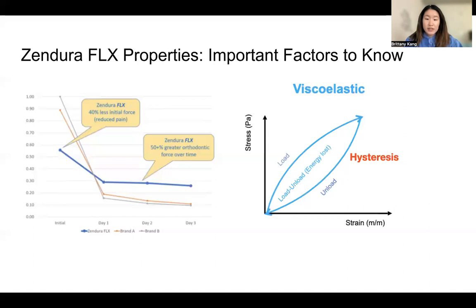The other effect is that they do have over 98% polyurethane resin in composition, which is able to provide not only high strength and ductility properties, but it also does boast clarity of material, which is for aesthetic purposes. This polyurethane resin has both thermosetting or thermoplastic. However, for the purpose of this use, the company does recommend using it for thermoplastic settings.